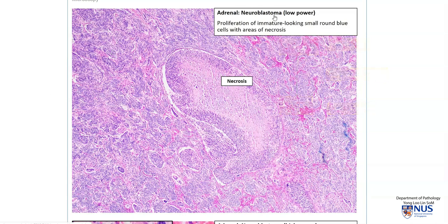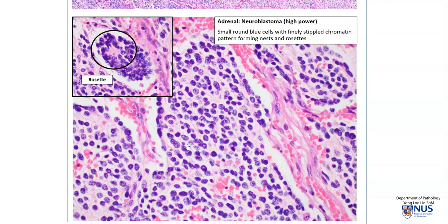These blast cells are called neuroblasts. On microscopy, we can see that this is a very necrotic tumor, which usually represents rapidly growing tumors. Moving to other areas, the cells are small and round — this is a classical example of a small round blue cell tumor. In some areas there is also rosette formation, which is quite classical in neuroblastoma.